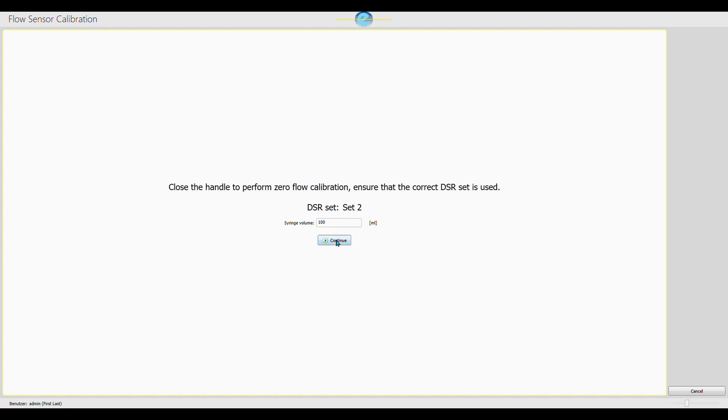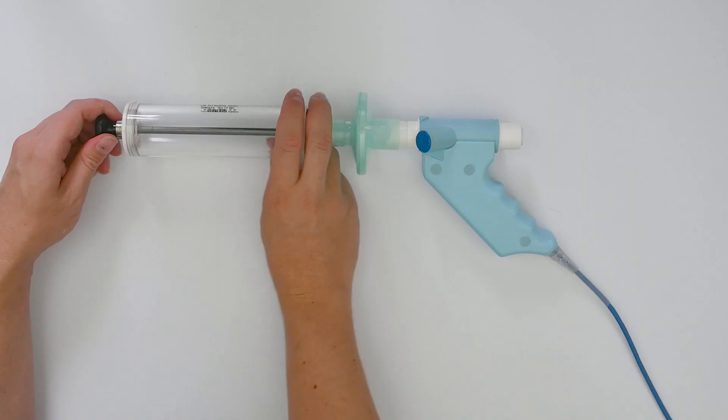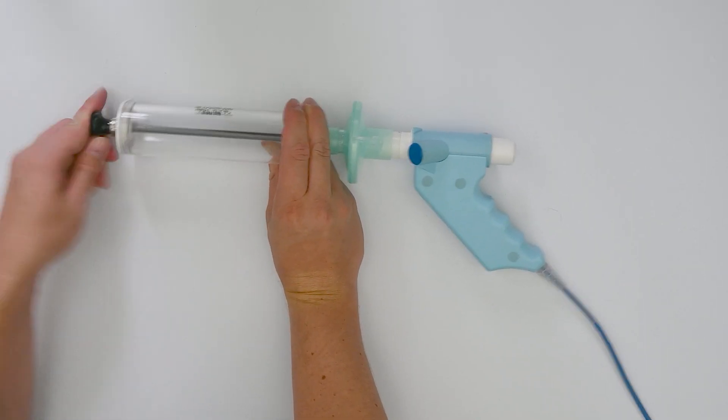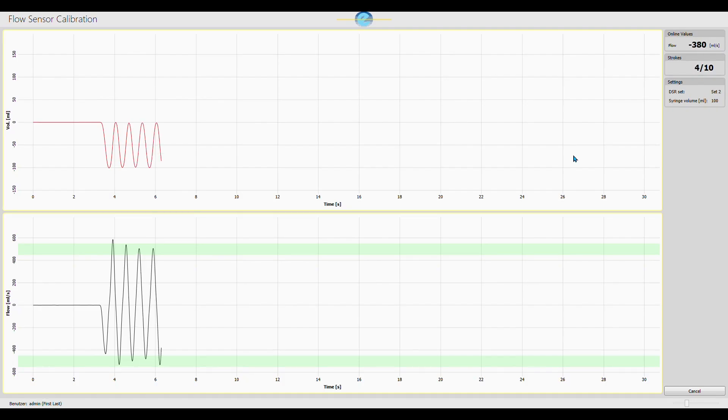When you see the calibration screen, perform 10 strokes with the calibration syringe. Ideally, the flow should be within the green boundaries. A green check mark signals a successful calibration.